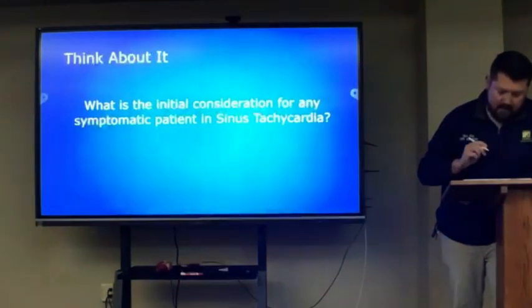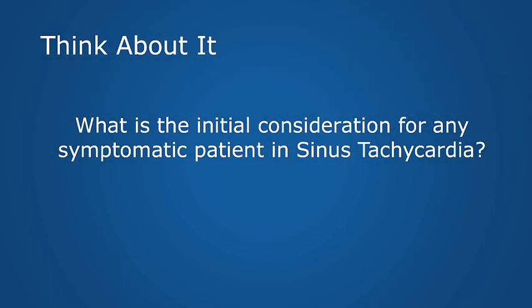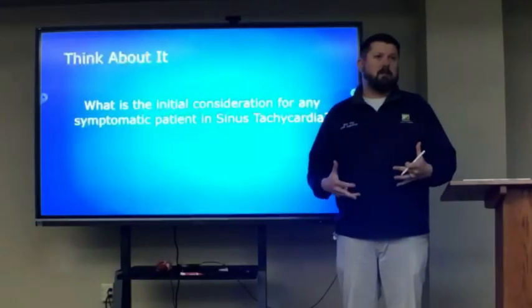So if you got a sinus tach, what is the initial consideration for any symptomatic patient in sinus tachycardia? Treat the underlying cause. Exactly. What is causing the sinus tachycardia? Because in most cases, if it's a sinus tachycardia, you're going to find out that something underlying is causing the sinus tachycardia, and something underlying is causing the symptoms. So oftentimes, the sinus tachycardia is a symptom of the underlying disease process, right? Most cases, when somebody is symptomatic in sinus tachycardia, the sinus tachycardia is not what's causing the symptoms in them.